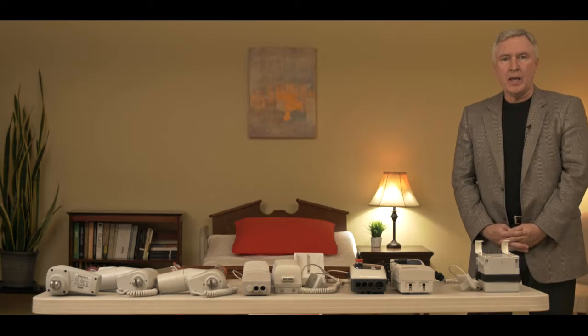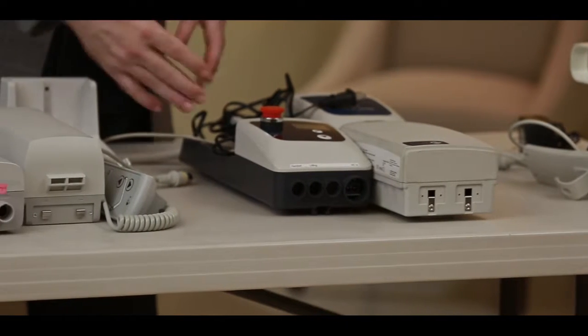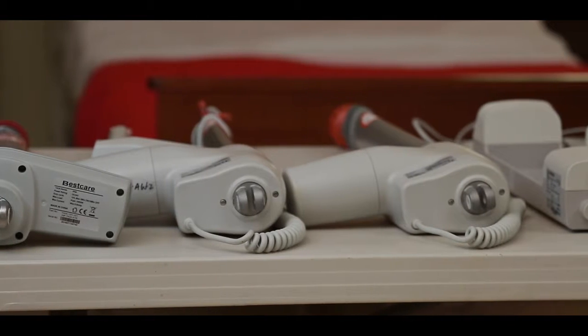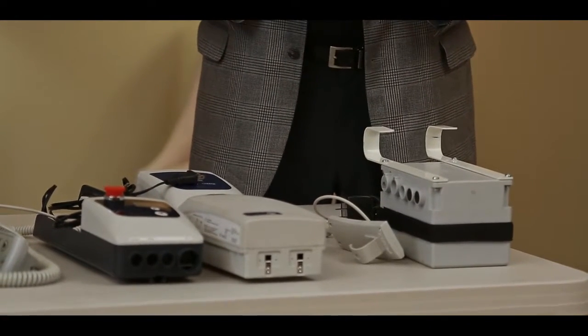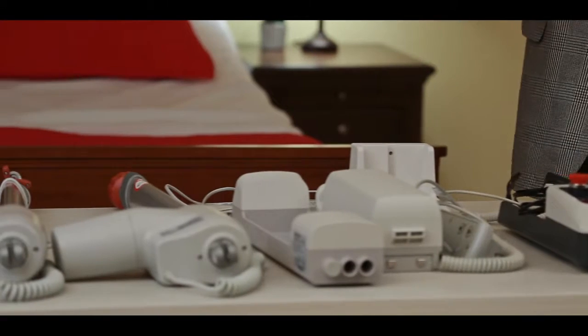What I'm going to be describing today are three styles of electronics that mount on your patient lift, and four styles of actuator motors that mount on your patient lift. The electronics package is the battery, the hand controls, the chargers — the things that power up your lift to make it function. The actuators are actually the motors that make the lift go up and down.